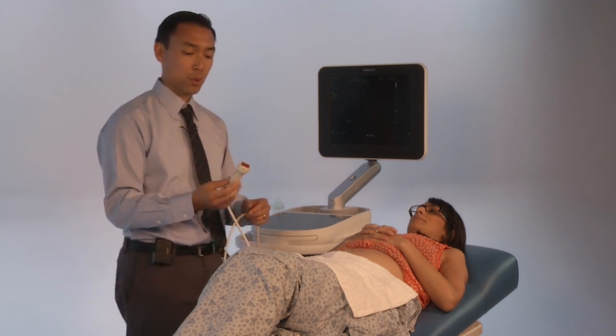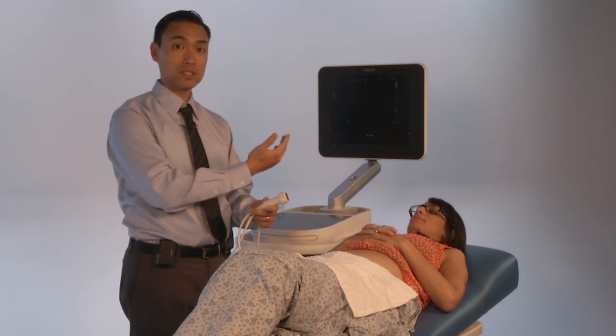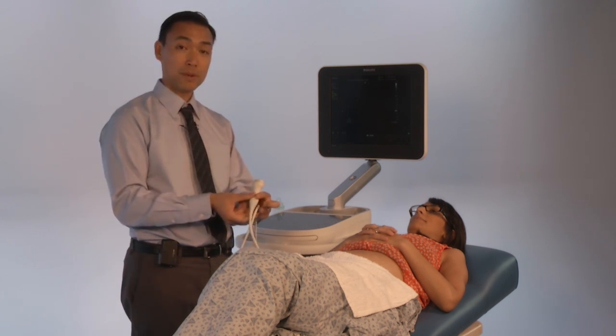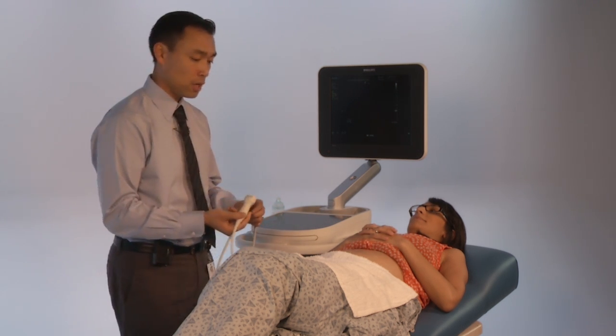For the probe indicator orientation, you want it pointing up towards the patient's head if you're doing a sagittal view, or towards the patient's right side if you're doing a transverse view.